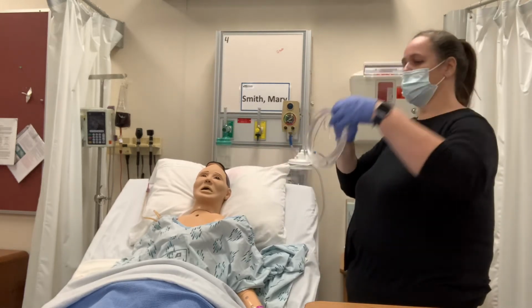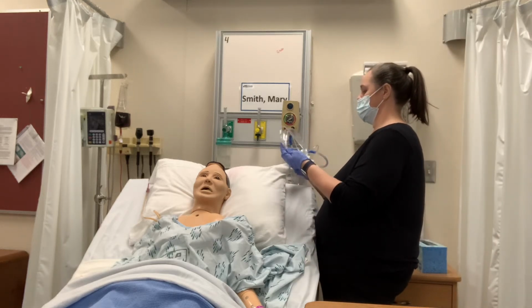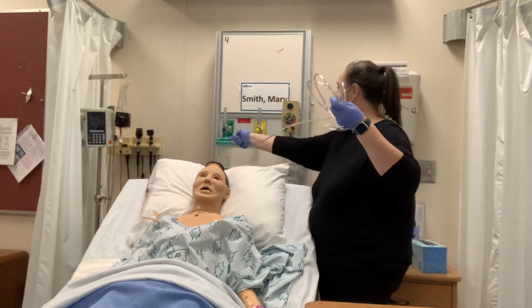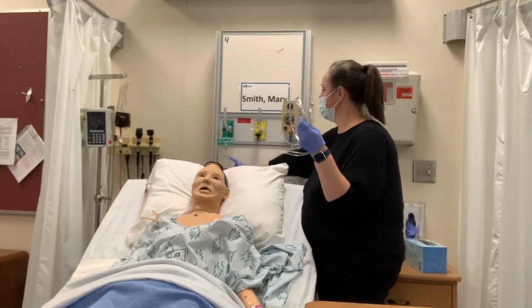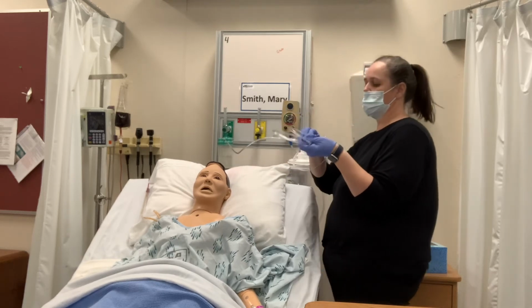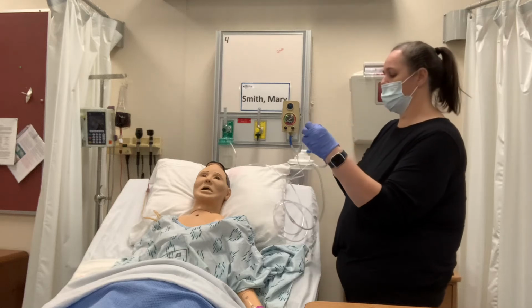I'll go ahead and attach my oxygen tubing to the flow meter. And I know my humidification is working because I can see bubbles coming out the tubing. And I know the air is flowing through the oxygen tubing as well.